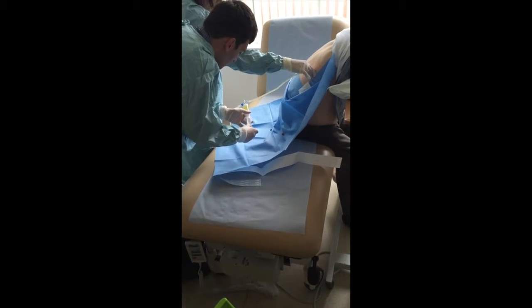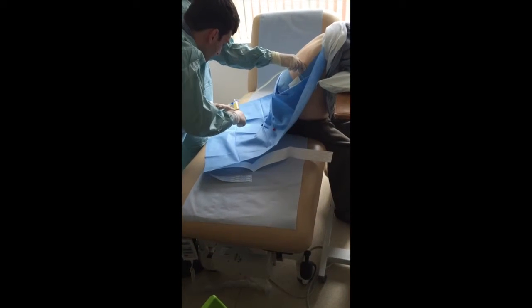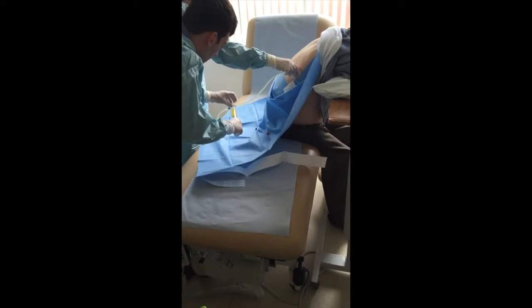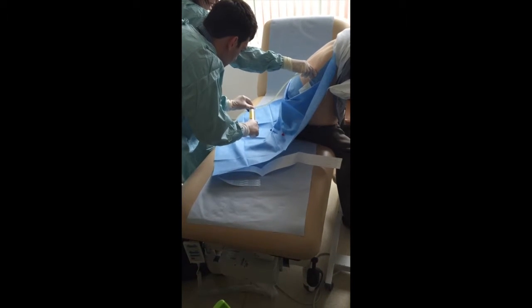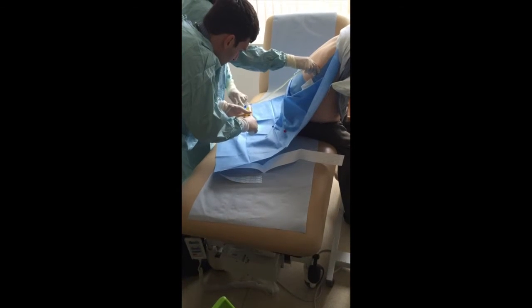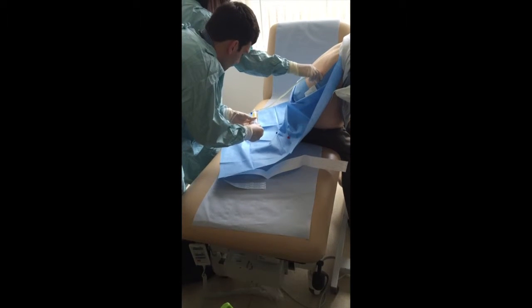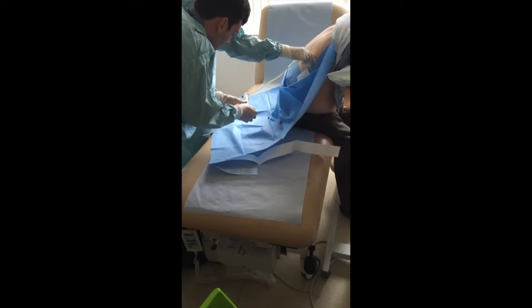Okay. And you'd fill that up with 50 mils, and then you're going to turn your 3-way tap so it's closed to the patient, so wherever the blank is off. So turn that right the way round, so completely closed to the patient. So up. So like that? Right the way up. It's going to be closed to the patient. That's it. And just squirt that into the bag, and what will happen is it will just squirt down into the bag. But gravity will do all of the work for you, so you shouldn't need to do that.